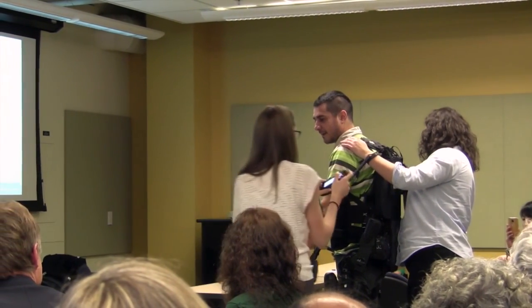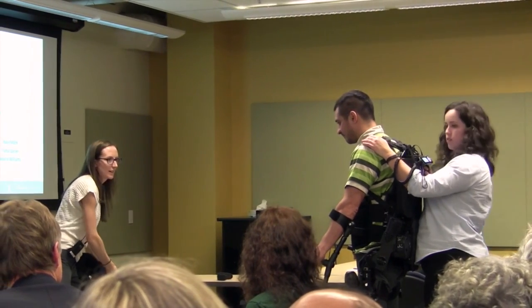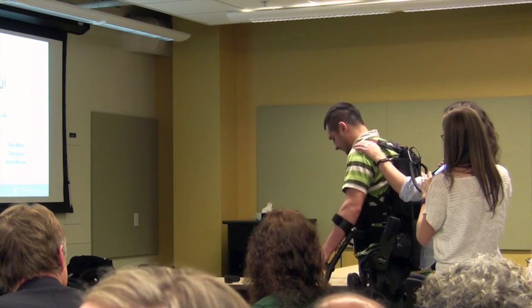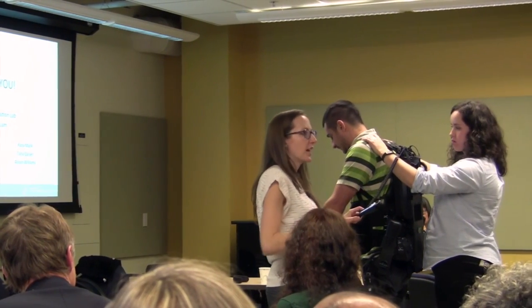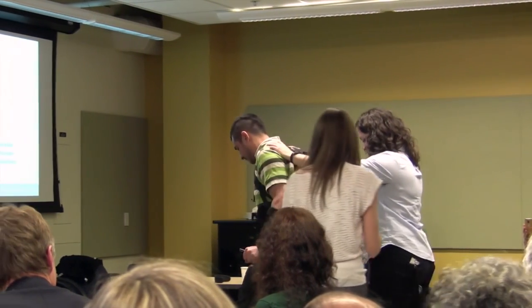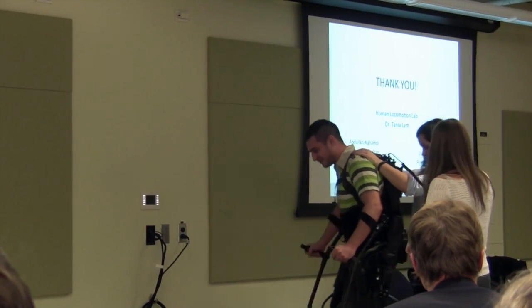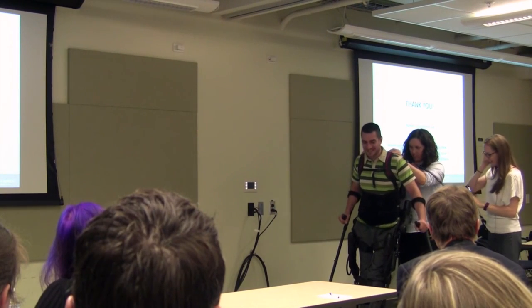Move the table over. So are we turning this way? We'll go that way. Okay. And so Kyle has to shift all his balance onto the left foot, and then a right step will initiate. I'm going to give him that. Ready? And then now he's under control with his weight shifts. Floor so slippery. Oops. Okay. Let's start again.